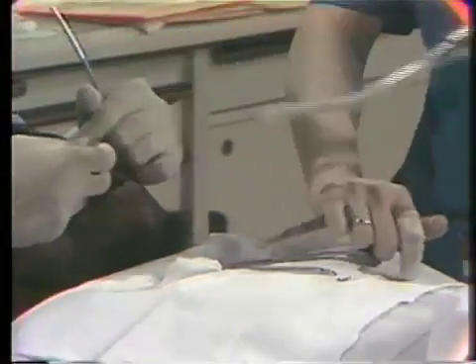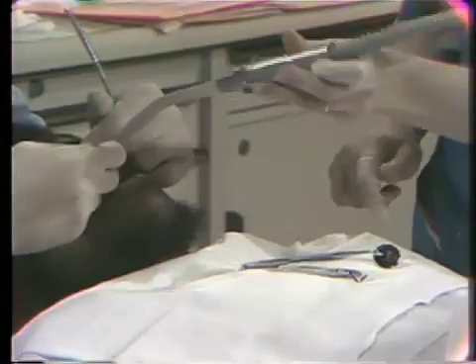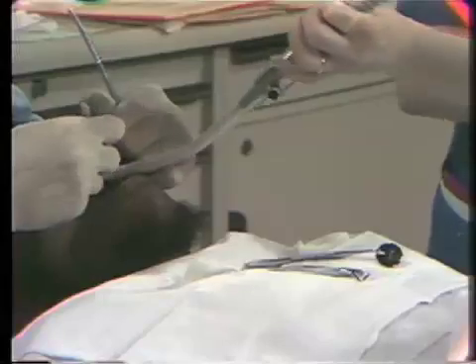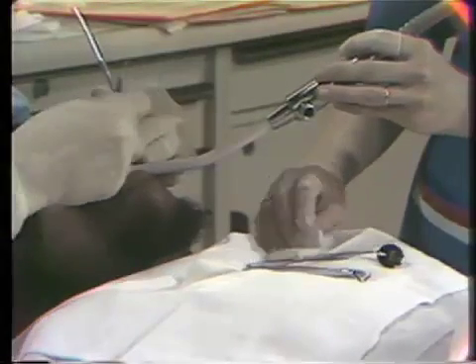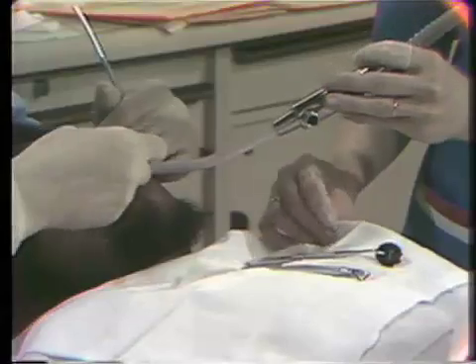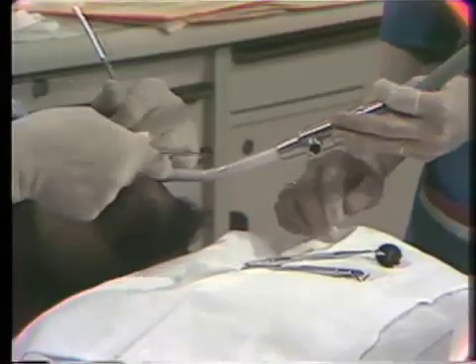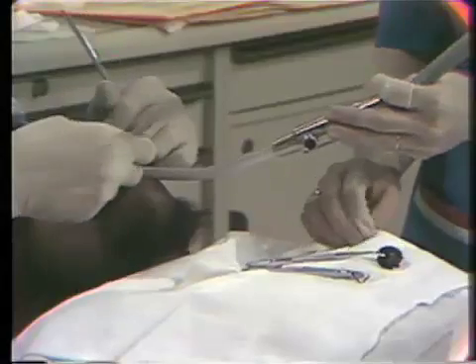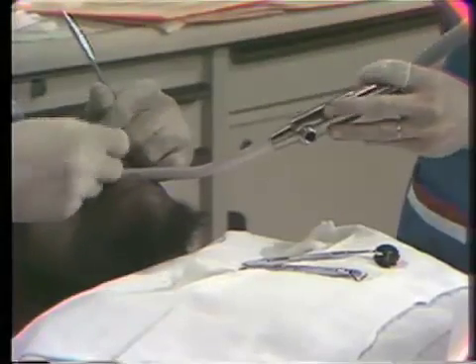Now, if you notice, Mrs. French handed me a periosteal. Now, I've already completed the incisions necessary with the B12 blade, the Bard-Parker B12 blade. And the next instrument I use is a knife curette, and she's worked with me for 3 years, so she had that ready immediately when I was through with the B12 blade, so I didn't even have to ask for it.